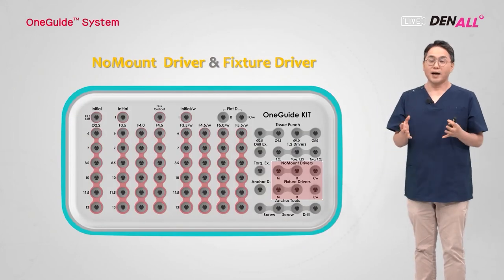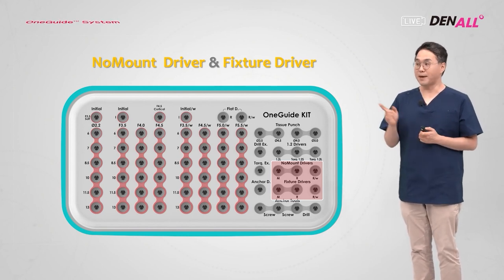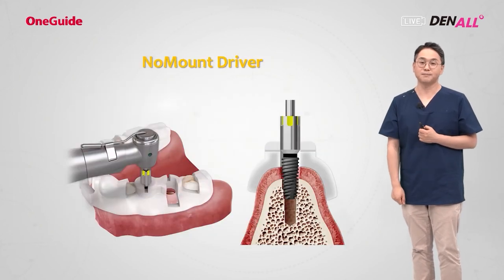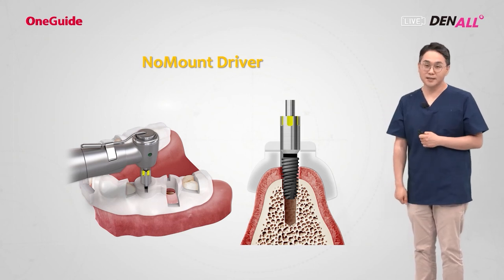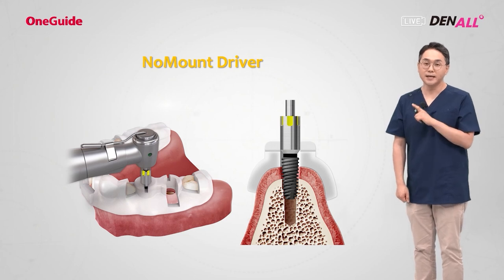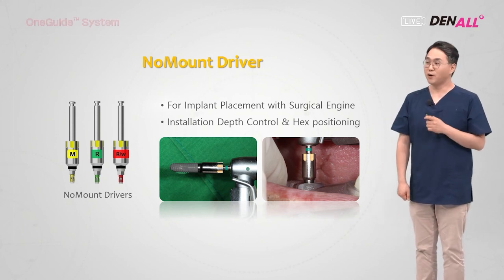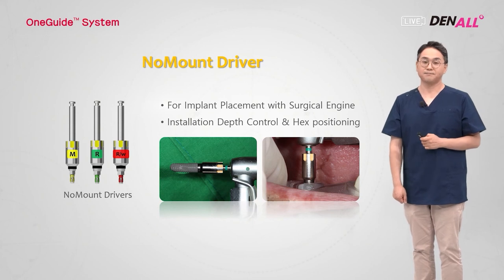Next, after accurate initial drilling, final drilling is done using the one guide drill, and implant placement can be done using these tools. The no mounted driver is used with a handpiece to place an implant through a guide hole. It is better to place up to 50 to 80% of the implant length with this no mounted driver. It looks like this. Installation depth control and hex position can be done with this.